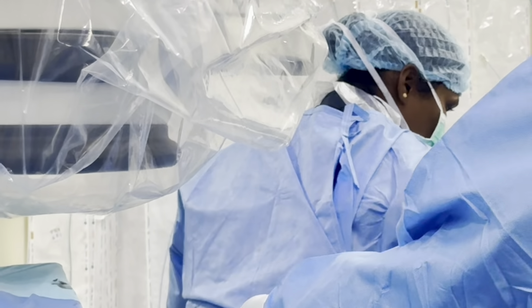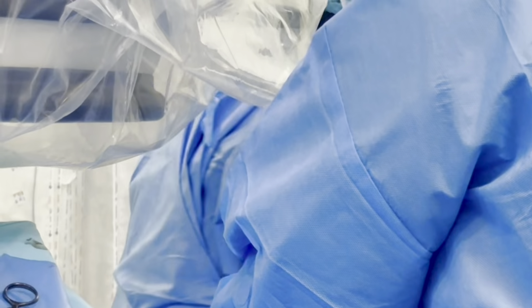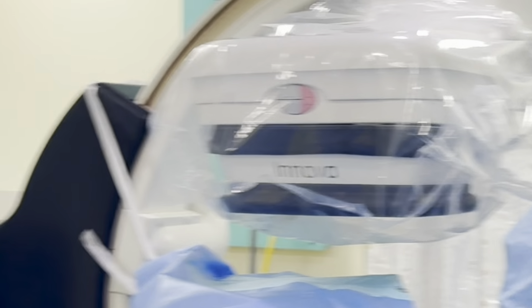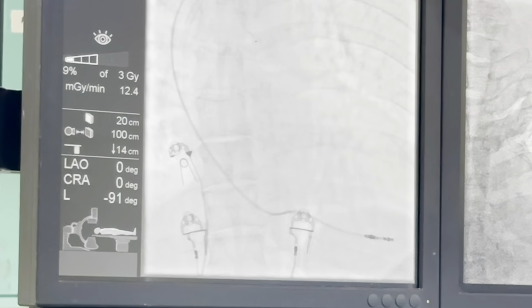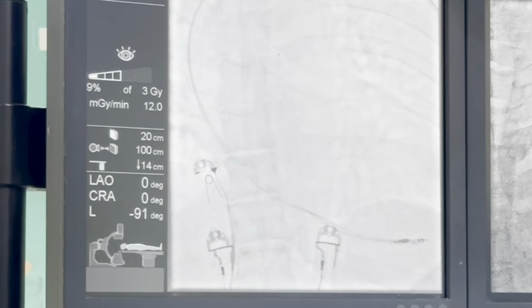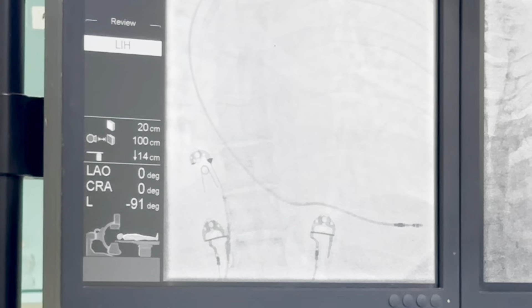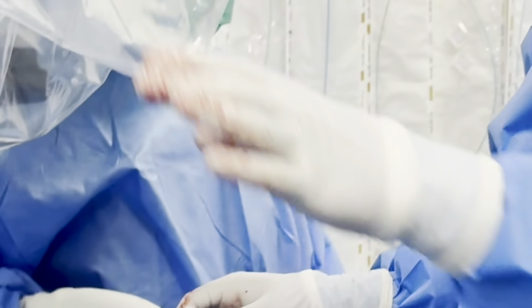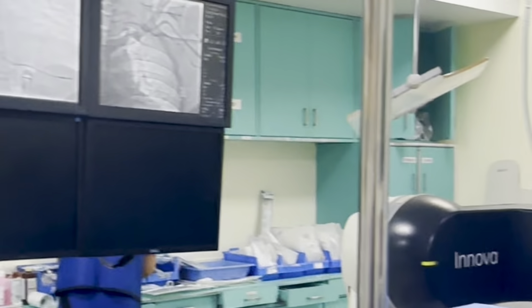Give us the flush. In the RA you need to flush it. It has been flushed earlier also, and now we will flush it again. This locator sheath will now take it into the RV to the desired location. Go to RAO, RAO 30 degrees.